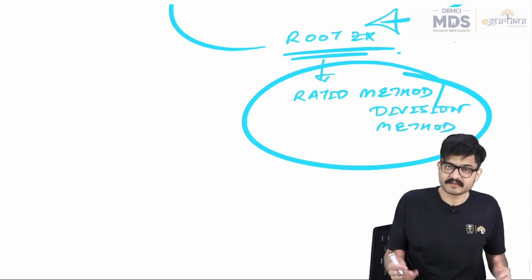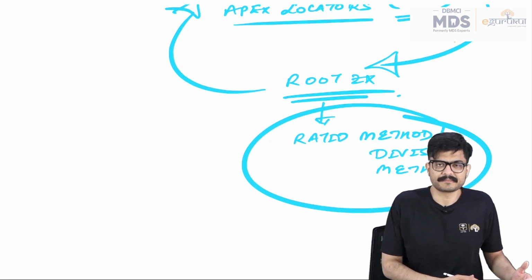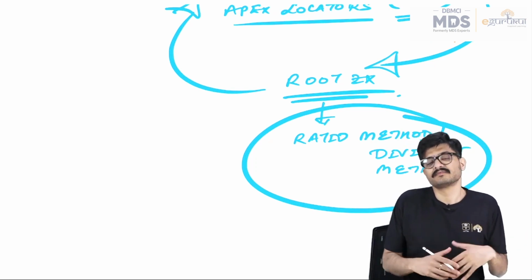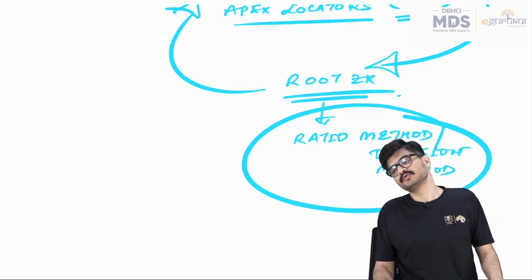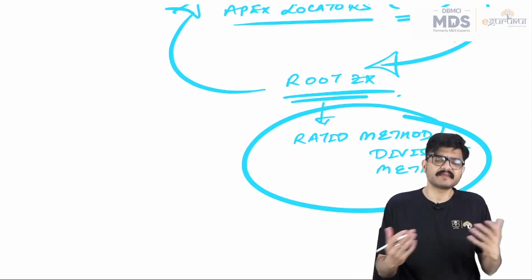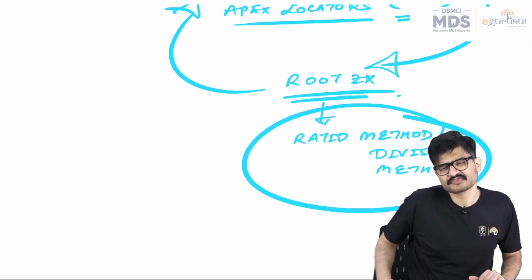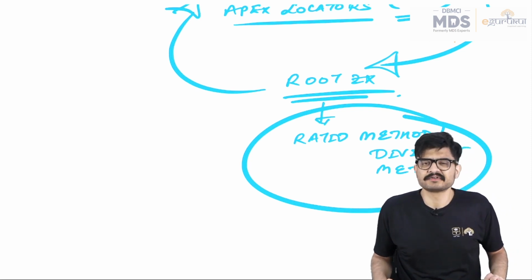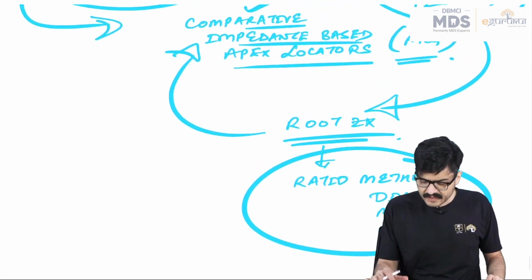If the canal is wet with any fluid like blood or sodium hypochlorite or abscess or pus, then also, the manufacturer says that it will give you a good accurate value. Although in general, a practical tip is that your canals should be relatively dry, irrespective of whatever advanced apex locators you are using, right?